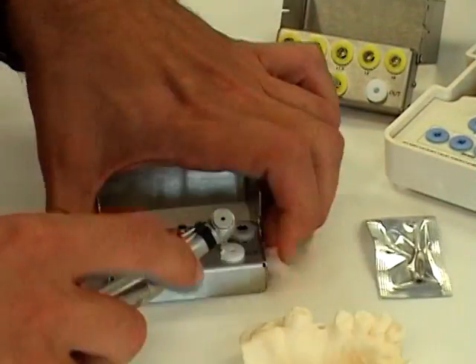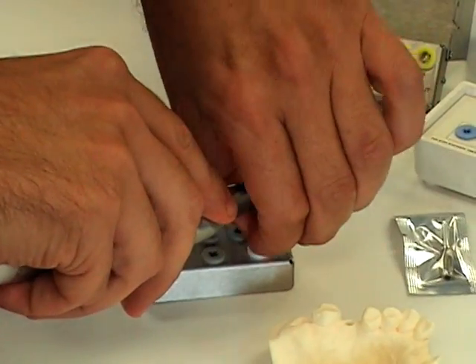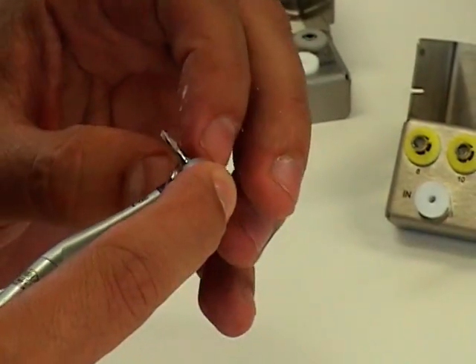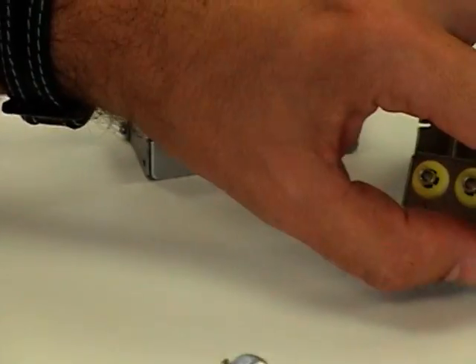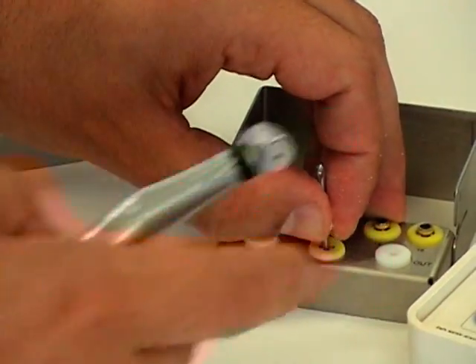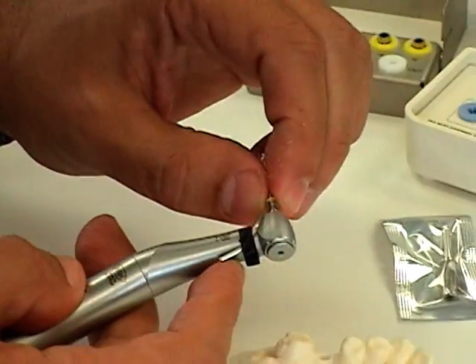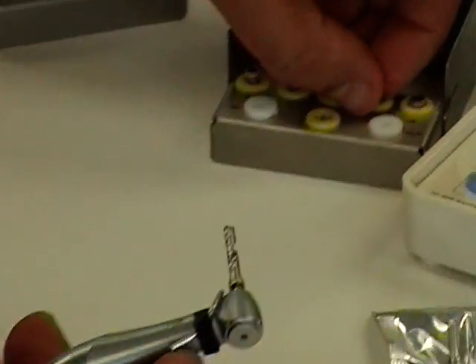You can use the outer portion of the drill stopper kit to remove the sleeve and the drill. Next, the 2.8mm drill, which is color-coded yellow, along with the stops themselves, which are also yellow.